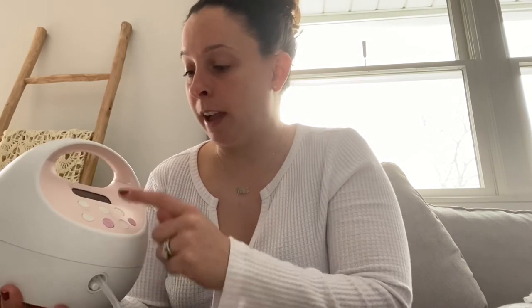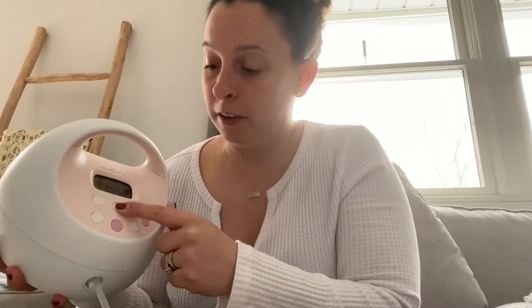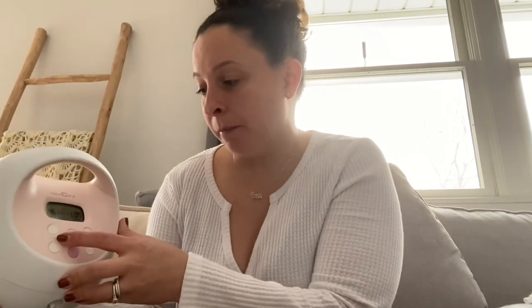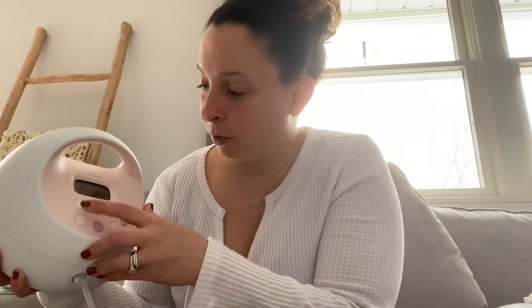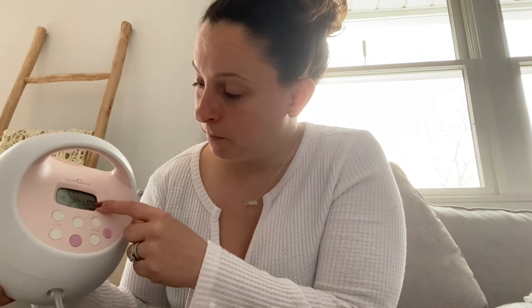Those are the settings for stimulation, which you switch to right when you power on. The other setting — expression mode — is when you're really getting the milk out. You can hear it go back and forth. That setting should be 46 on the cycle; she told me 45 or 46 depending on which version of the pump you have, but my version uses 46 for cycle and a vacuum of 7 on the right.